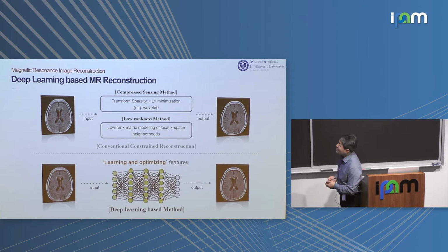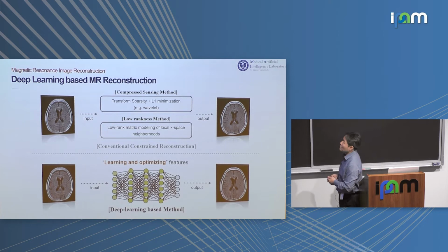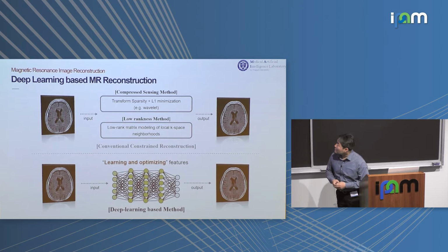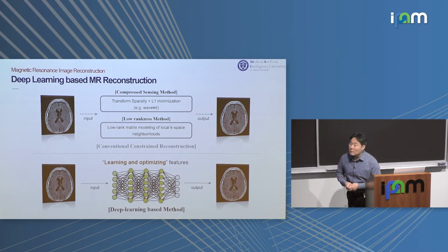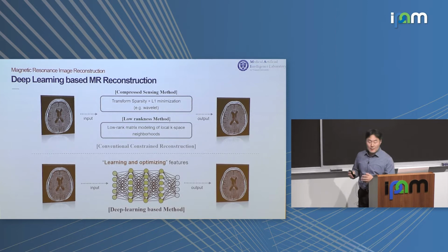Those reconstructed images look pretty good, and I love it. But when I ask the doctors about the quality of the images, sometimes they do not like this style because it may contain some artificial appearance, such as piecewise features, or small details that are over-smoothed, etc. The reason the image may not be completely natural to the doctors is that we are imposing some regularization that may be biased to human thinking, the total variation or too much smoothness constraint, which may not be natural.